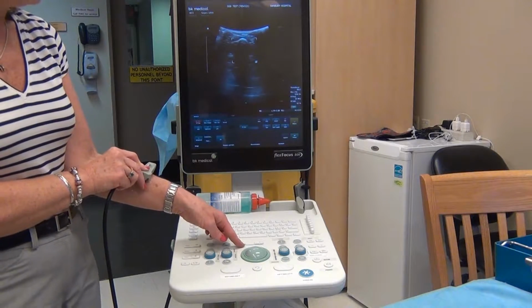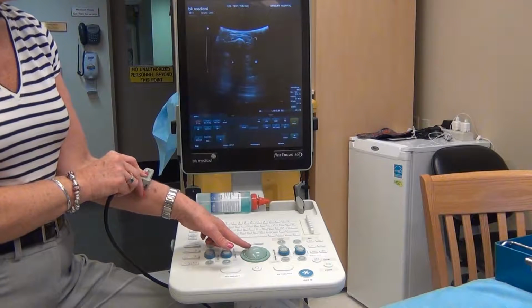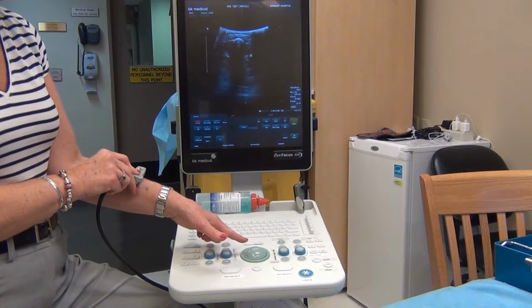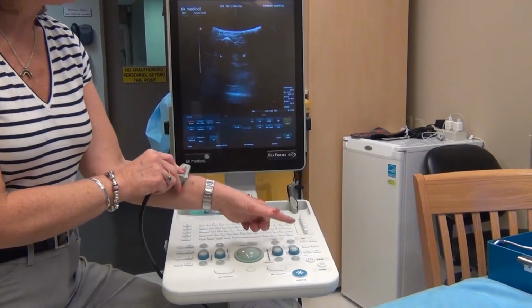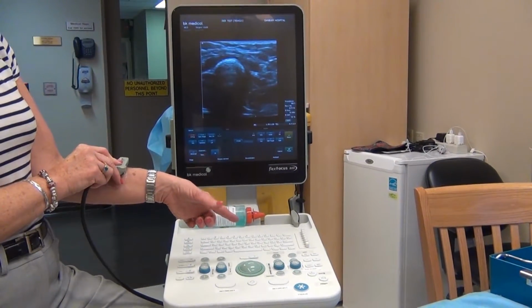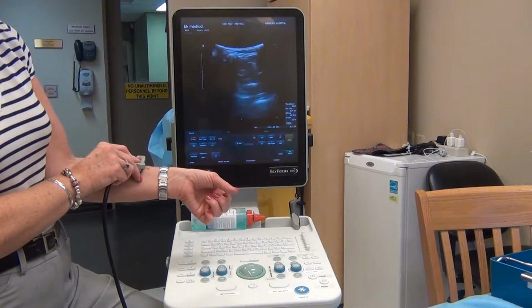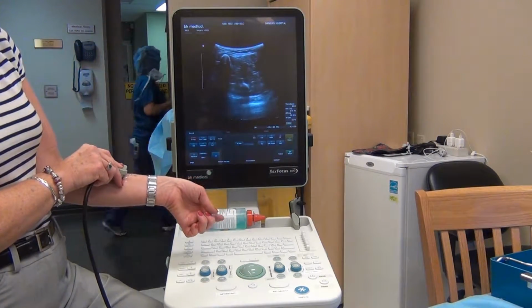When it gets to its maximum or minimum size, it's going to beep at you. So it beeped. This is the smallest I can go, but I'm just going to move the box up, right there. Now I want to magnify that area right there. So I'm going to push the magnifier again, and we're in a magnification mode. To get out of the magnification mode, just push the magnifier again, takes you right back to your original depth.